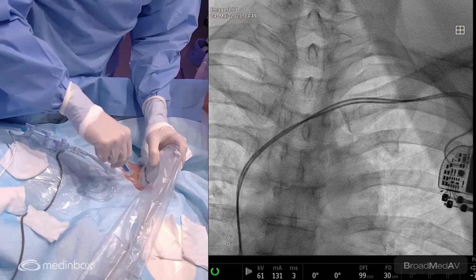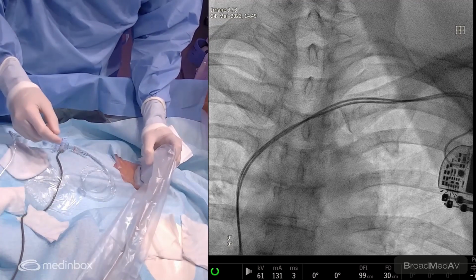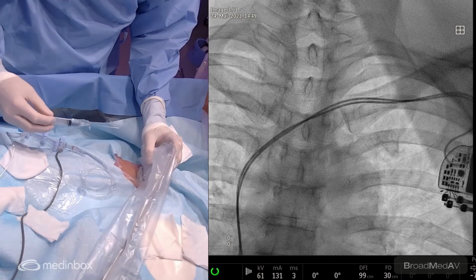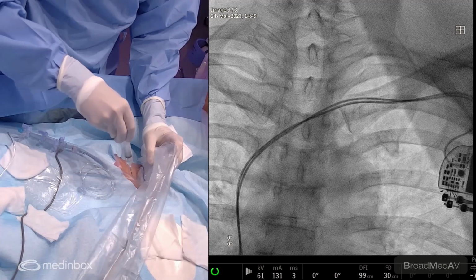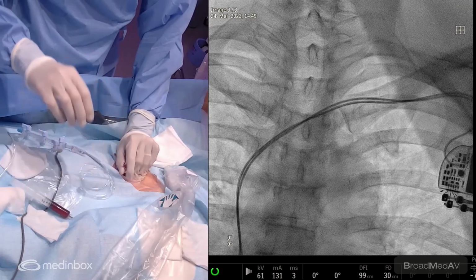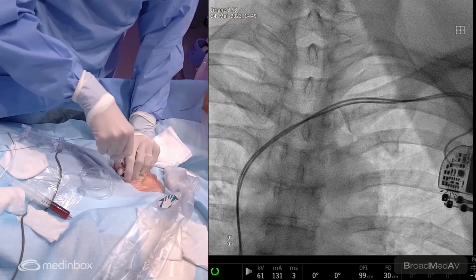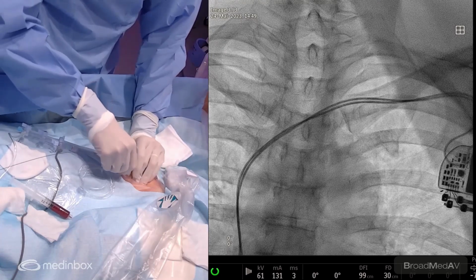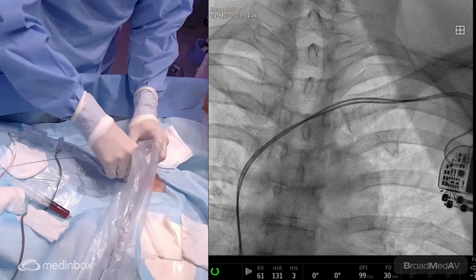In this institution we often like to do the puncture under guidance of the V-scan from GE. But for the purpose of this live case, we are using the echo console that we will use for intracardiac echo after. The image is quite nice. So first puncture in the vein. This is puncture number one, we saw well the needle under the echo probe. So we'll put the first wire in place, and you will see that we will not put the introducer yet. We'll just keep this wire to do the second puncture more easily.